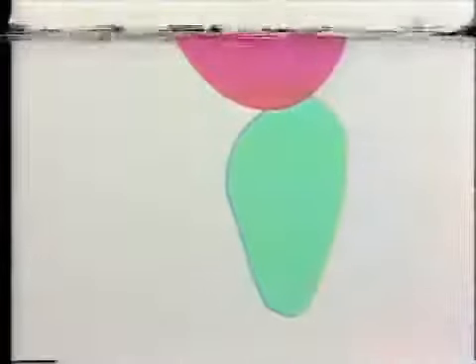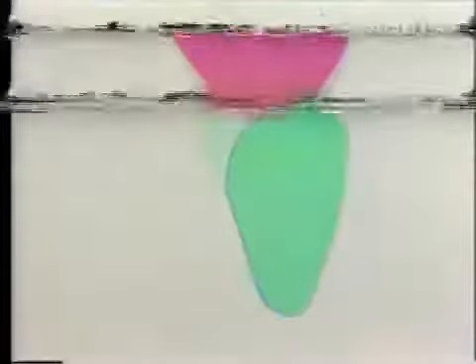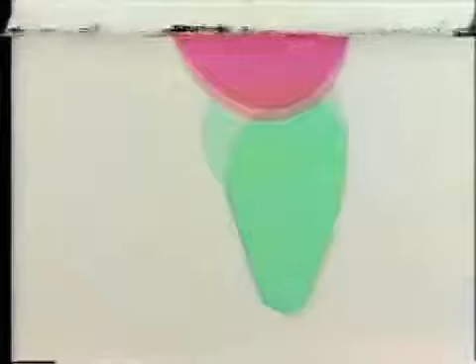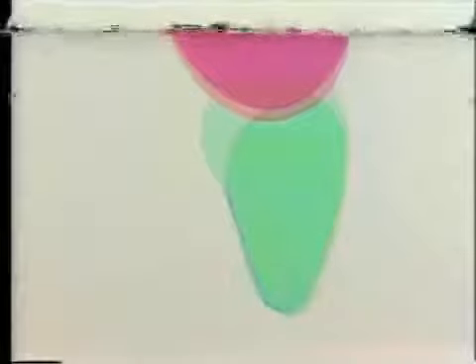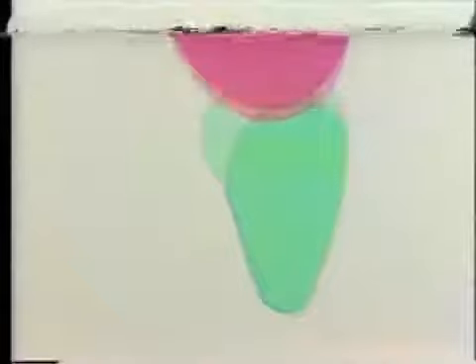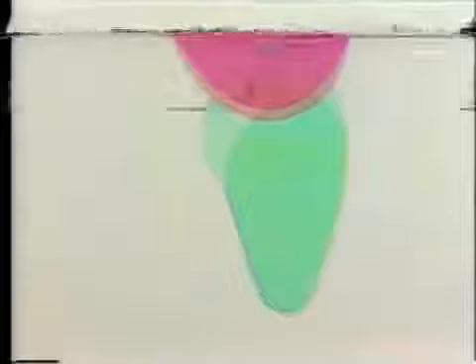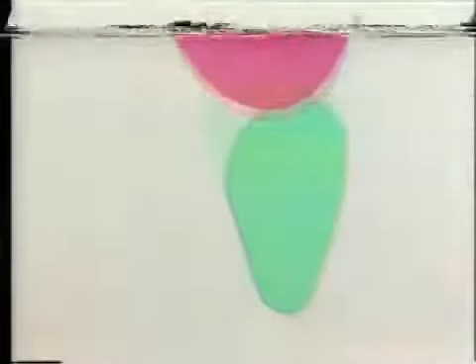And if we can superimpose the original natural tooth over this, I think you can see how the level between the point of contact of the cervical of the natural tooth and that of the Pontic is at the same vertical level. Our Pontic seen from the normal view would be of the same length as the original tooth. This has been achieved by swinging in the labial surface of the Pontic in the cervical third.